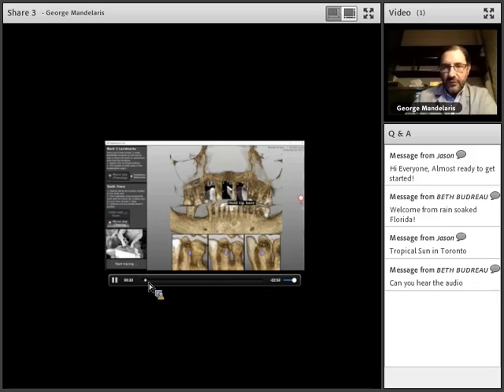And you can see where it'll say hold the tip here. So that's our first indicator. So there she is holding it. It's registered it now. The micron tracker has picked it up, and now she's doing contact mapping. She's basically got 6 points so far. She's going to hold that again, make sure that it registers. Once it registers, she'll finish the contact mapping. There she is holding it to the tooth. Once it registers, and now she's basically mapping out 100 points on the tooth so that it's registered.